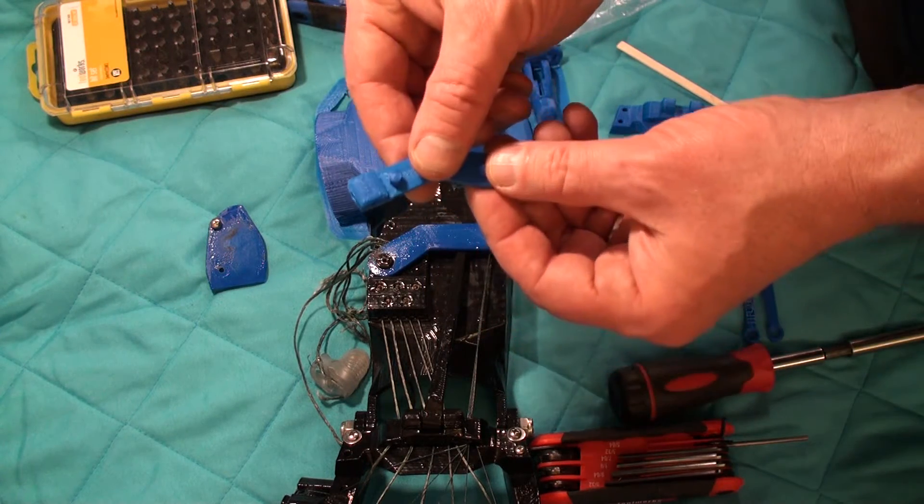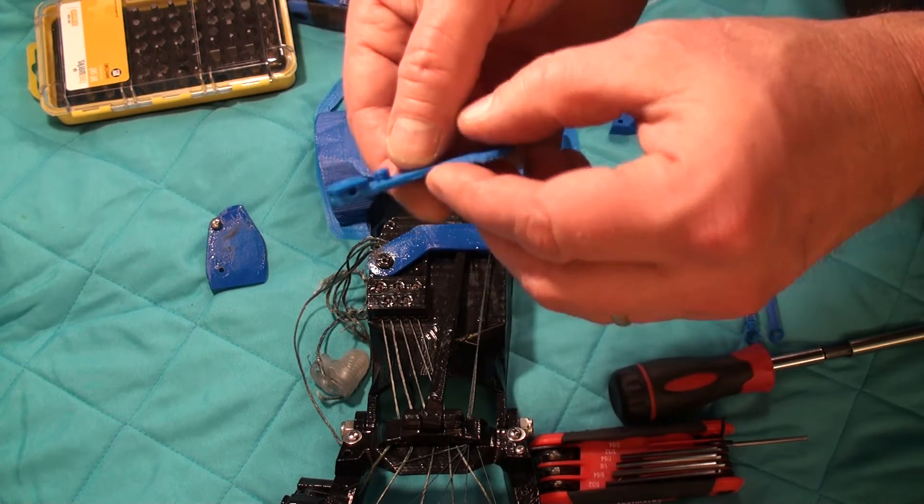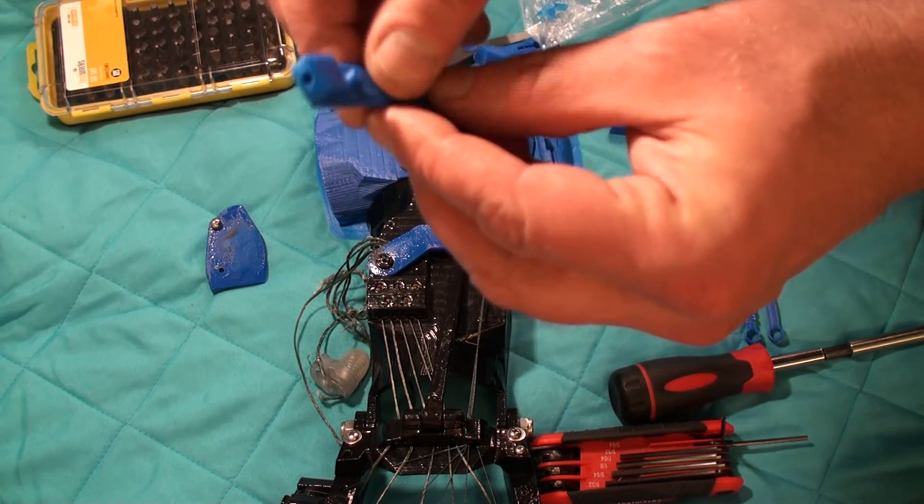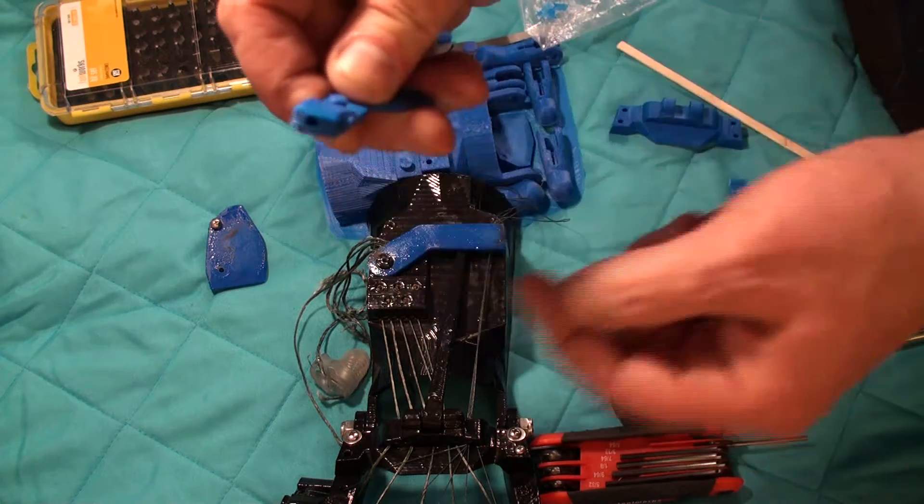Here's a pivot that's printed, and you can see there's a hole that runs all the way through here, and there's the hole that intersects it in the side.